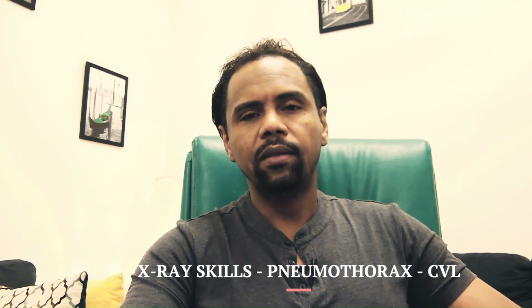I'm so grateful to meet you today, and today we are going to discuss a new station in critical care. It is a straightforward station, but it needs some skills. You want to know how to read X-rays. This station we can name pneumothorax, and you are going to be asked some questions about central venous line insertion. So let us go to the questions.